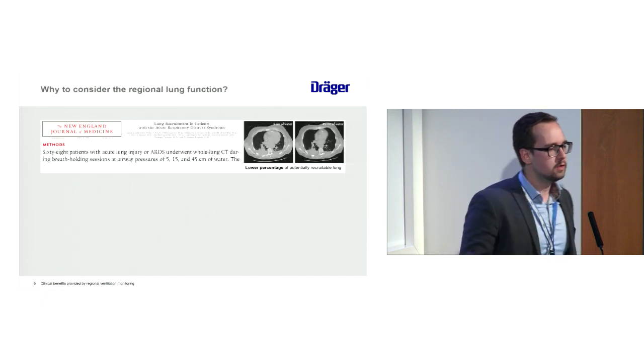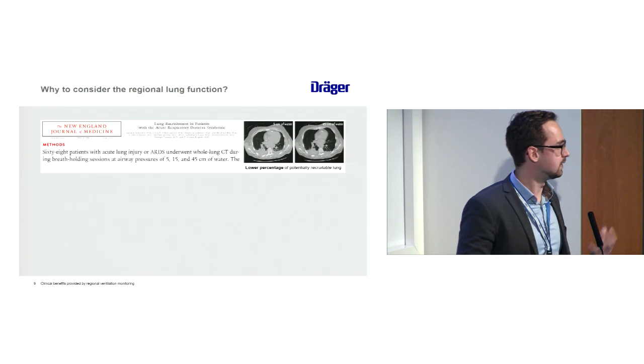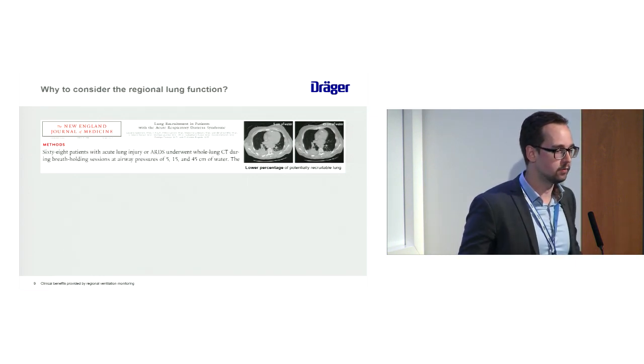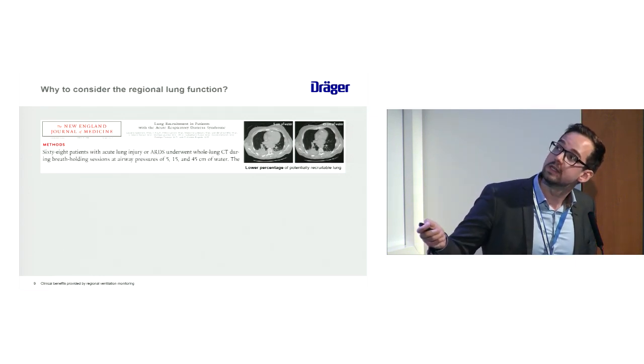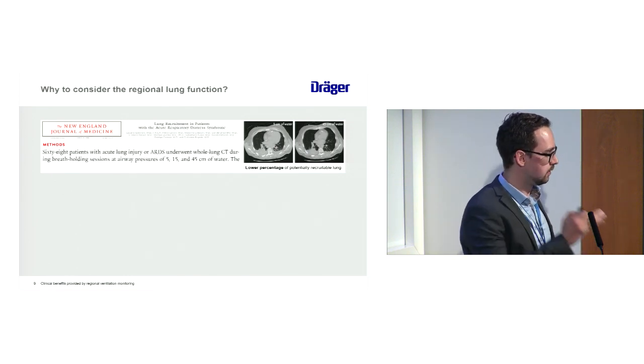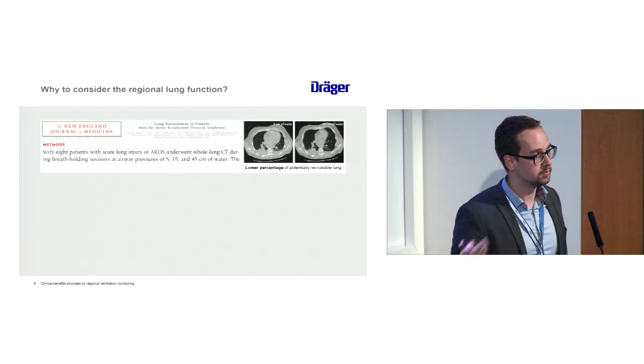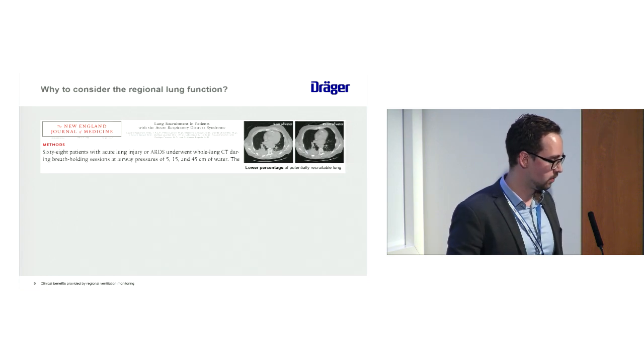When we continue, we see that each patient responds in a very unique way. I would like to refer to the study done by Gattinoni that was looking into the response to recruitment maneuvers, and was differentiating between responders and non-responders to a recruitment maneuver.